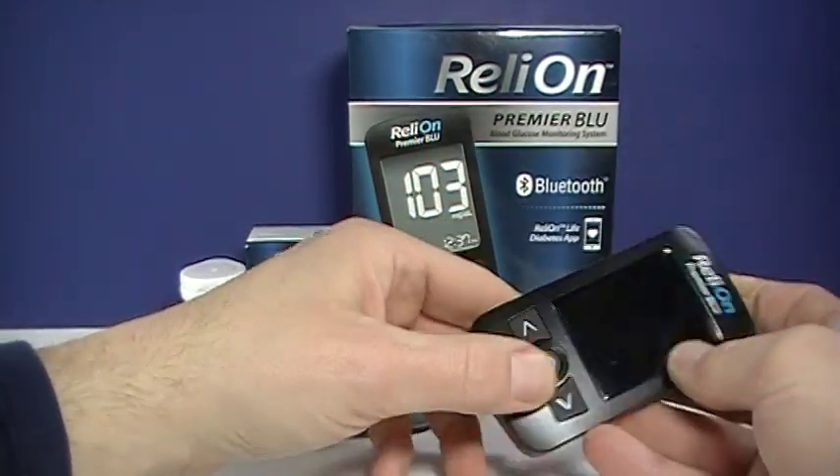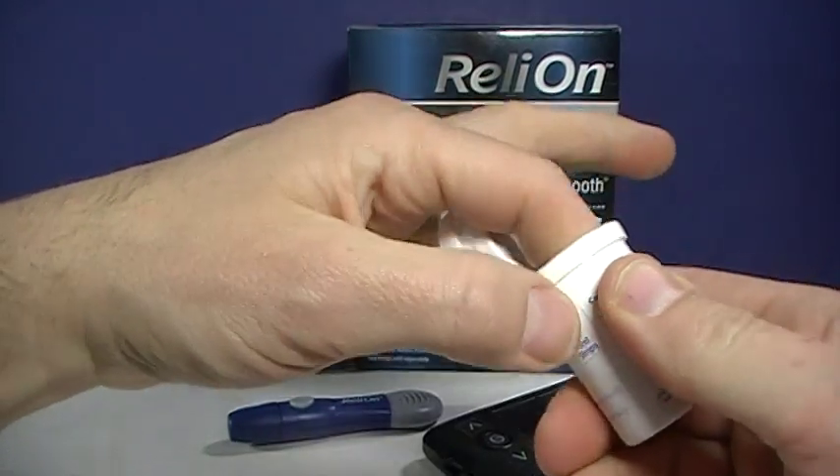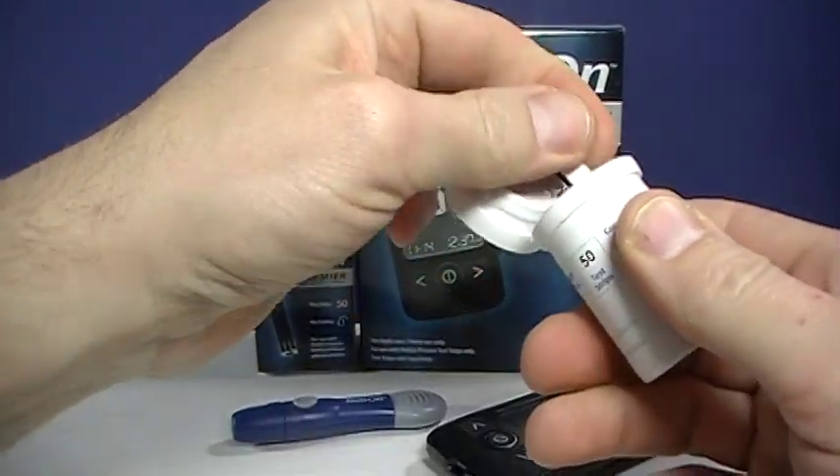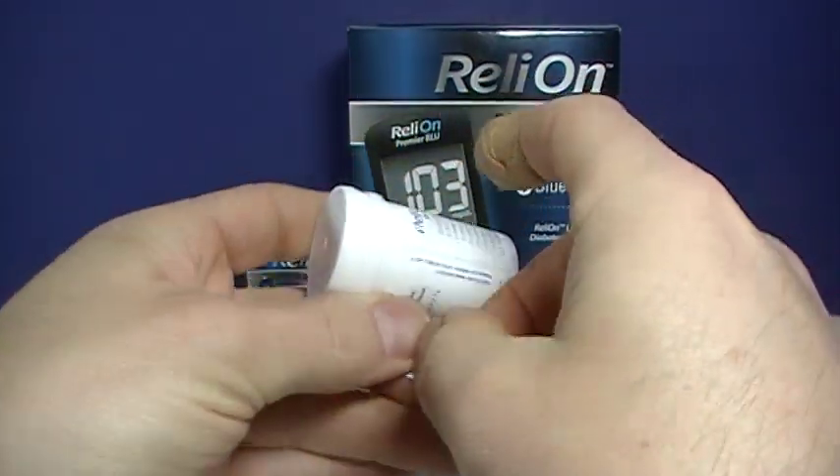I'll show you a quick blood sugar test with that, and then we'll go on to some other functions of the meter. So of course, get a test strip and seal your bottle back up.